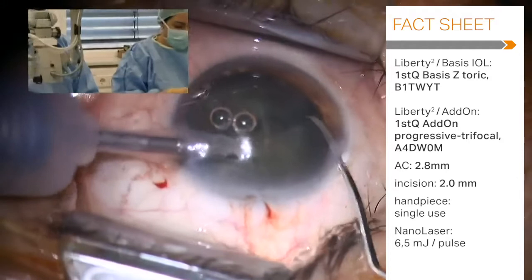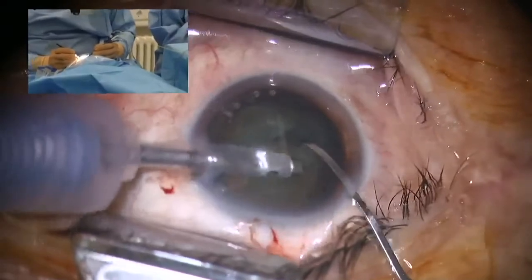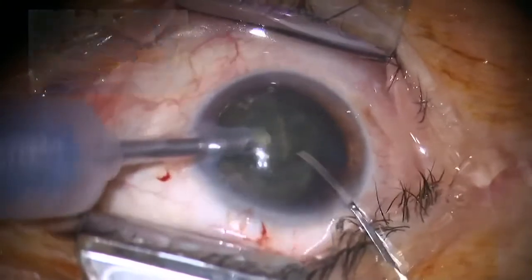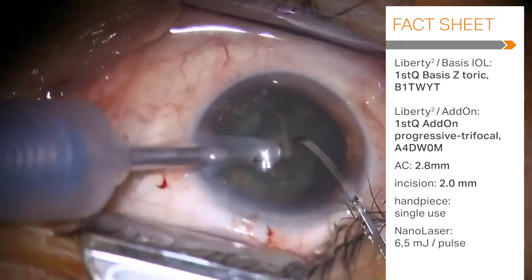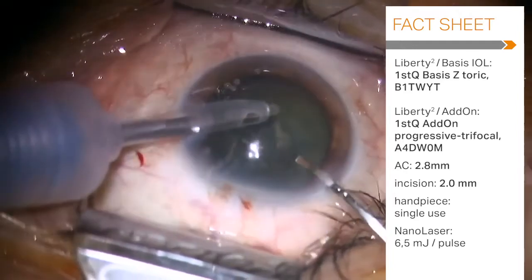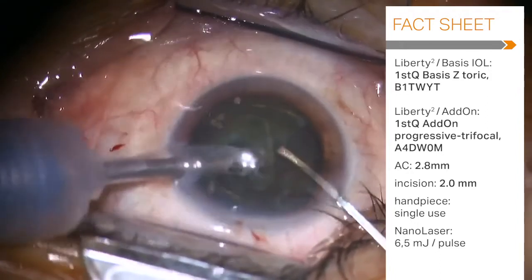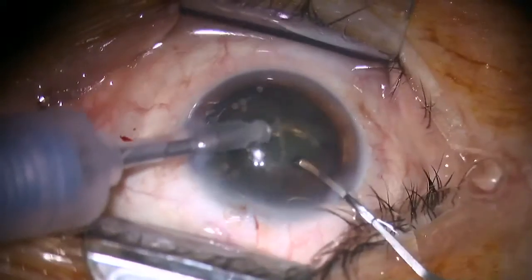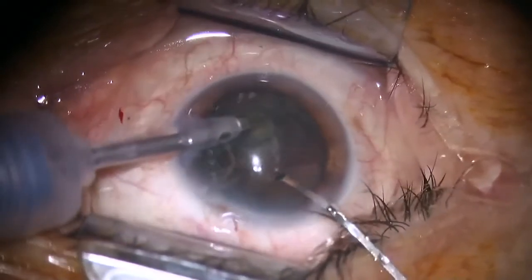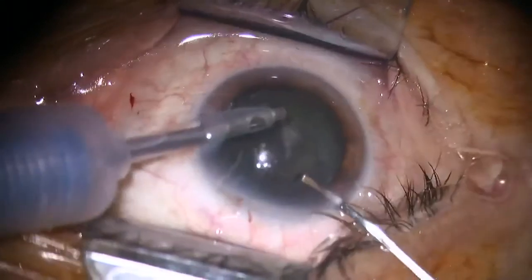Now we try to remove the lens. The system we do so is the Nano Laser from the A.R.C. company, which I prefer in our premium cataract patients throughout the last 6-8 years now. The system totally avoids any amount of thermal or mechanical damage during the process of the removal of the lens. You hear the clicking of the laser. This is, from my point of view, the surgical system with the lowest energy applied in the eye to remove the lens.